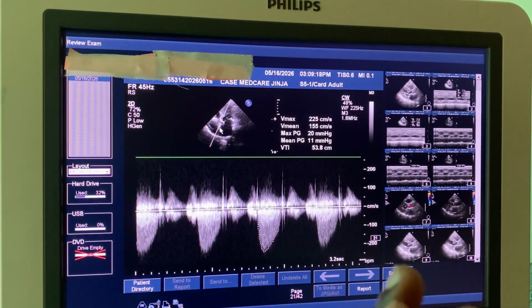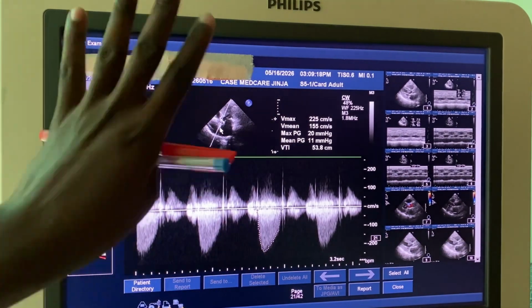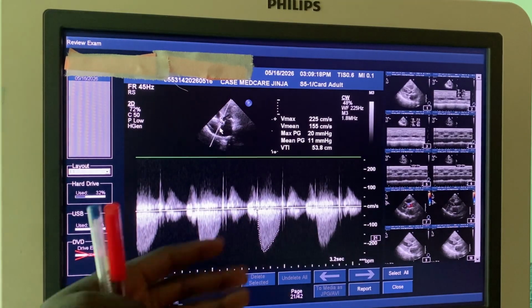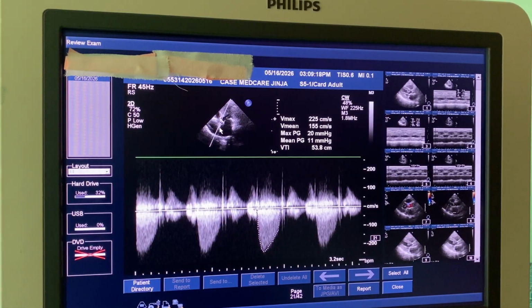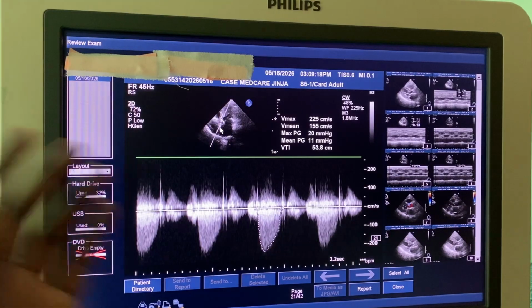So in cases where we find that it just opens like this, chances are that the ventricle is not pushing a lot of blood, and we can increase it. We can make the ventricle push more blood by giving a pharmacological agent, dobutamine, the drug. It makes the heart beat so strongly.